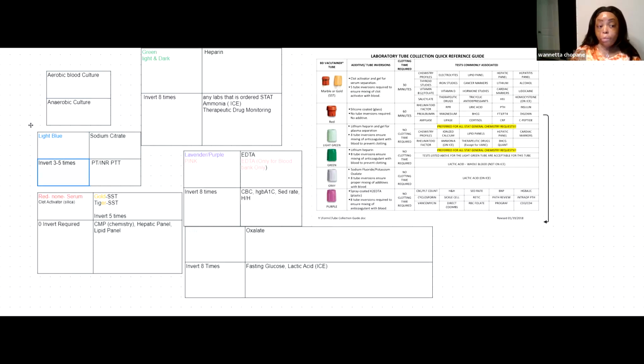The most common test is PT/INR and PTT. Remember, we talked about that. So I'm going to just go ahead and reiterate and go over what I went over already, it doesn't hurt. Okay, so I have my separate box.